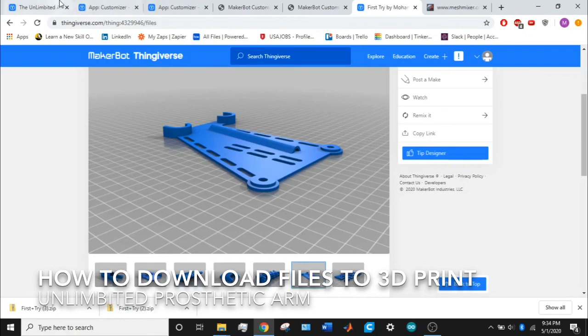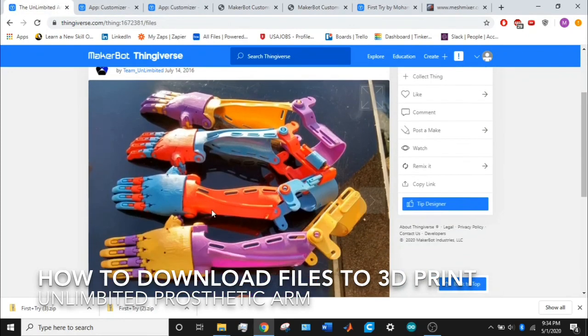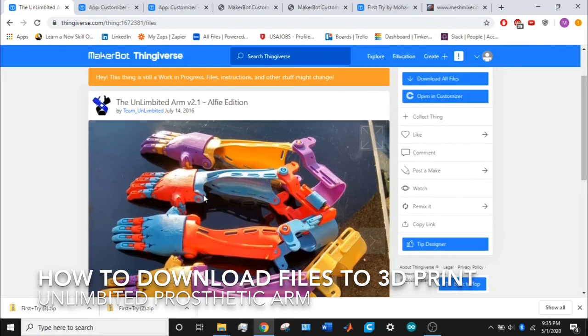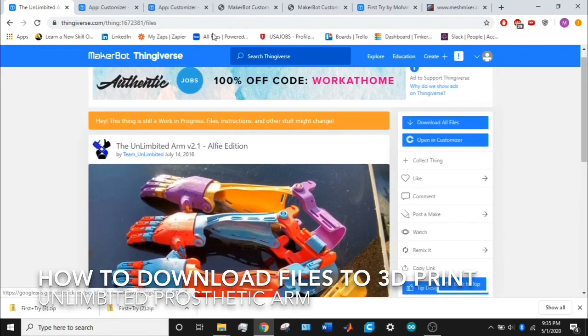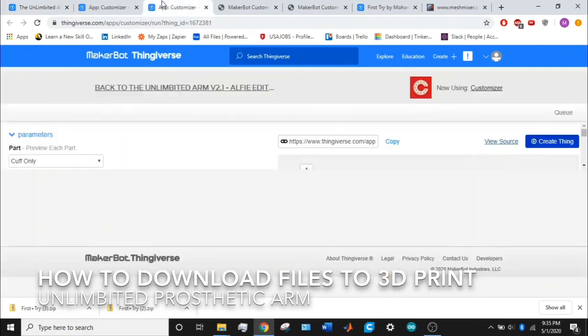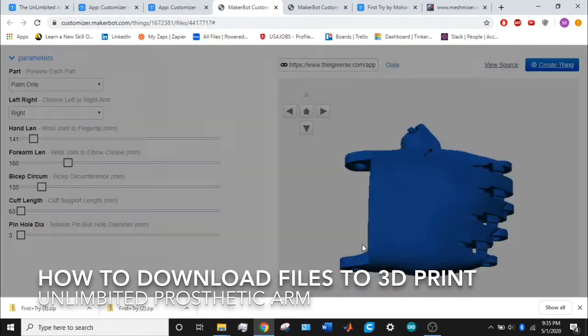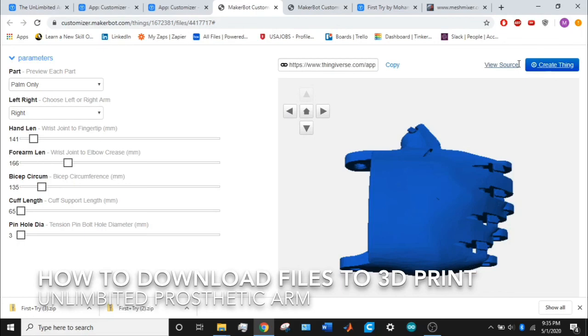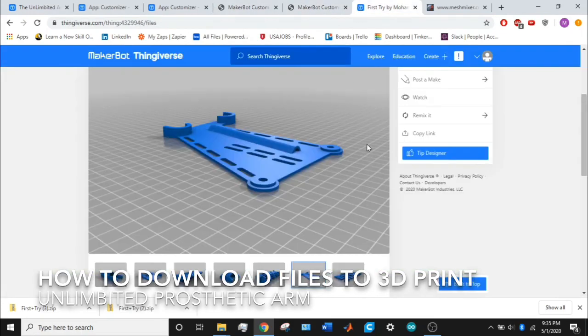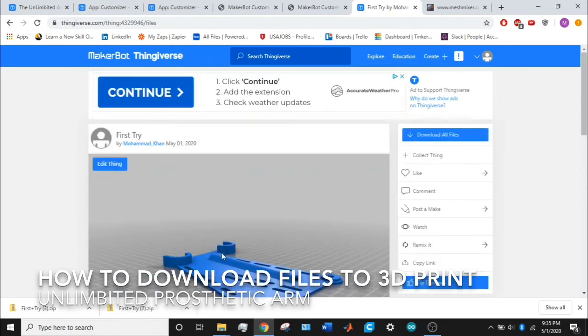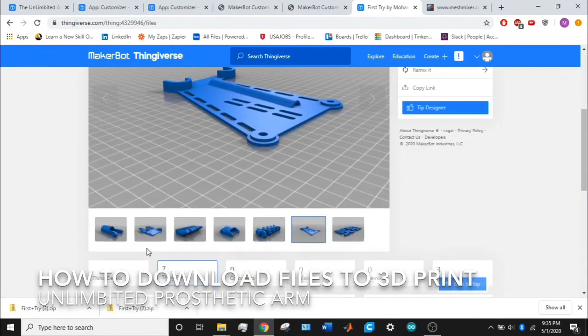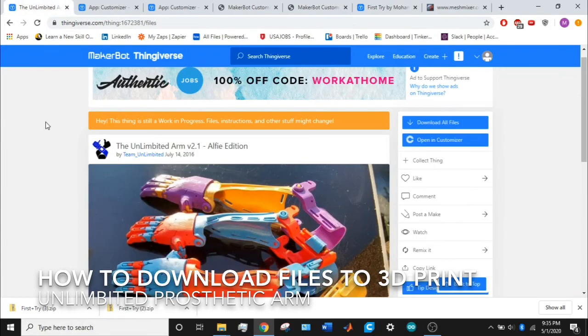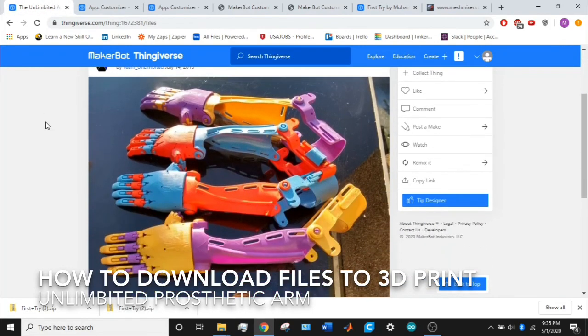Other than that, this is how you get to downloading those files to 3D print the unlimited prosthetic arm. Just go to open customizer, put in the proper measurements, then create your thing, send it to the queue, and once it's done, download them and send them to your 3D printer. That's how you download the files so that you can 3D print the unlimited prosthetic arm.